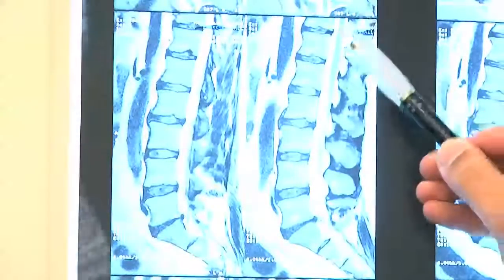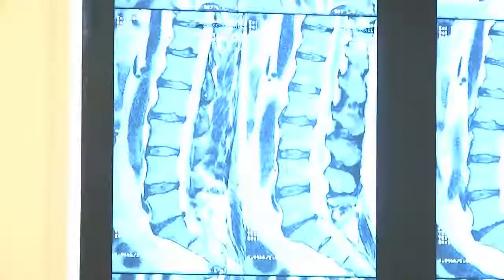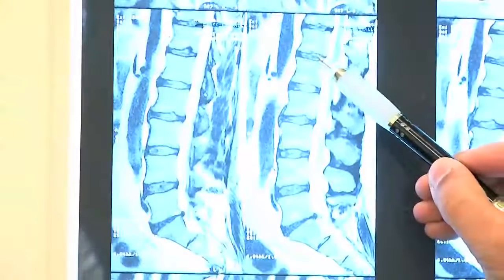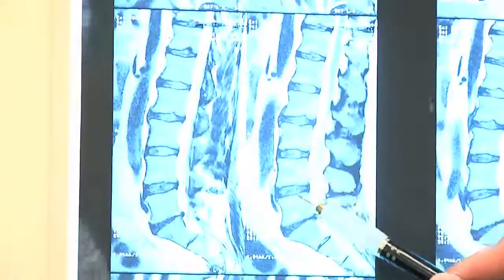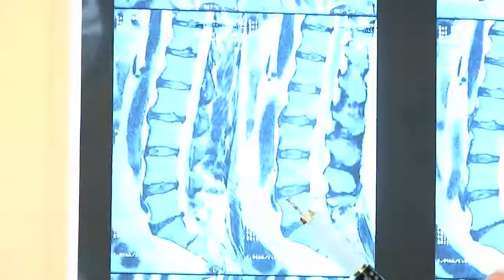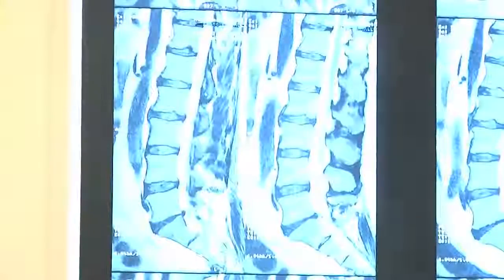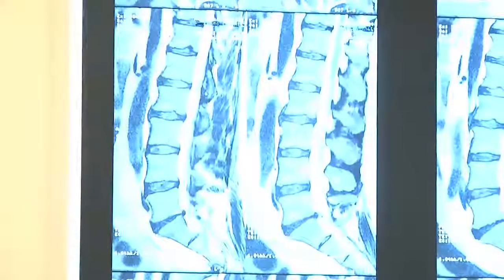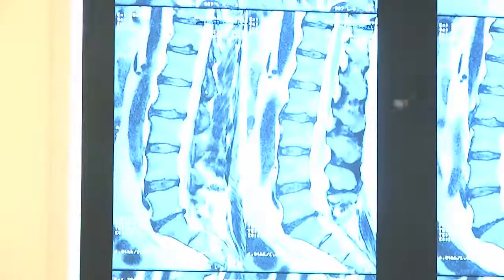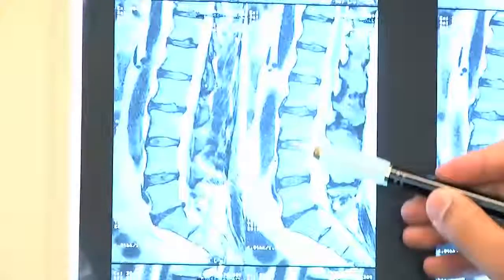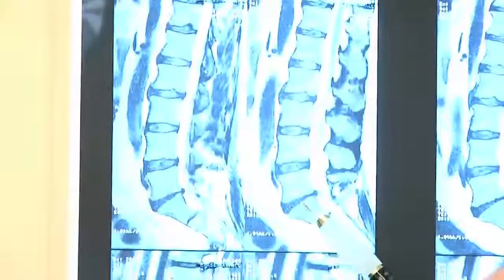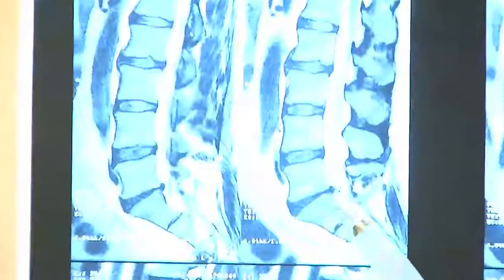Now let's look at this patient — we've crossed out the name for HIPAA regulations. As you can see, these discs look very similar and they're nice and light, meaning they're nicely hydrated. As we age, the discs start desiccating — they lose their water content. It's like a fruit: when it's nice and fresh and juicy it's very good, but it gets dry and loses its water content. You can see that one disc in particular is very different: it's narrowed, bone is contacting bone, the content has been squeezed out, and you have a herniation or bulge in the back.